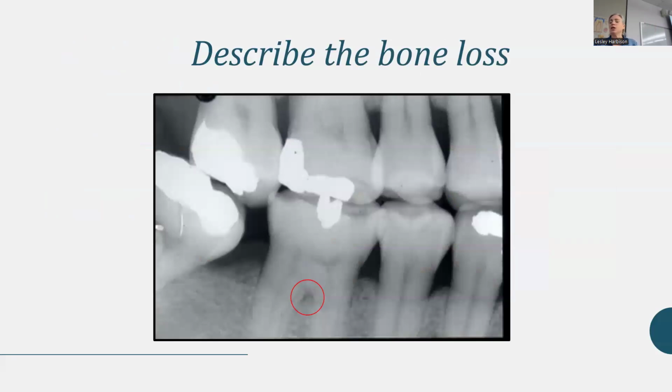And then, so we just look at the bone loss here. So in general, what would you guess this bone loss is? Yeah. In general, I feel like the level of bone loss is probably even closer to a 2, but you'd bump them up. If this was an exam, you'd bump it up to a 3 just because of that furcation involvement. And it also looks a little bit higher up here. So some of these areas don't look that bad. They kind of look like maybe they're in the 2-ish range. But like here, that's probably maybe going into a 3. Up here, it's harder to see, but that might be more of a 3. And then we have this furcation involvement.